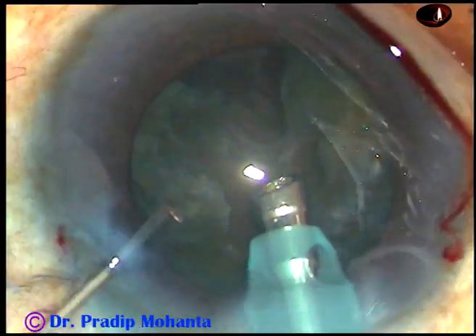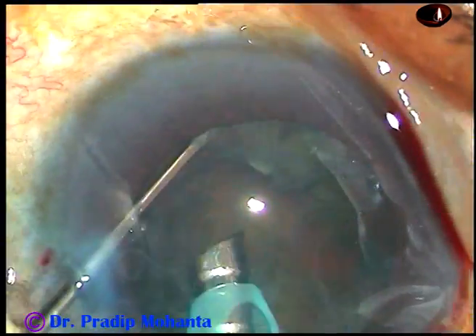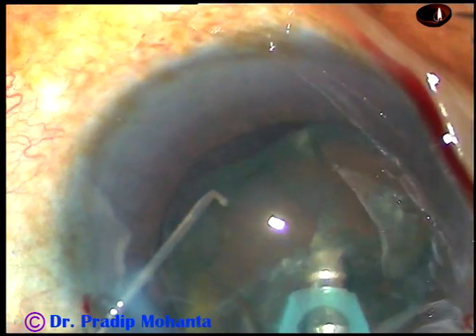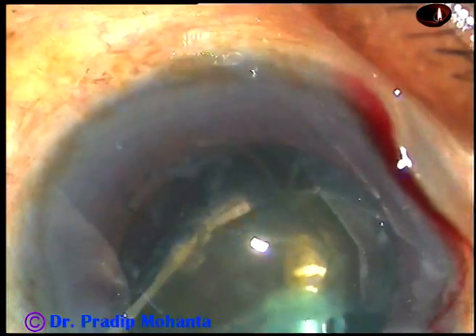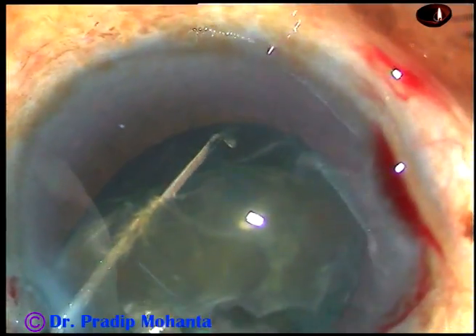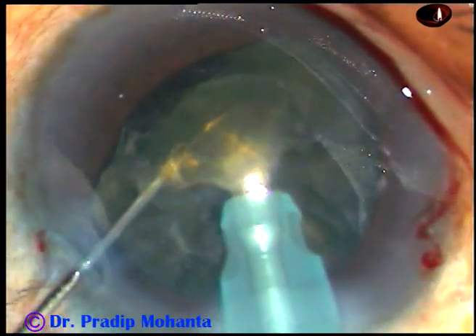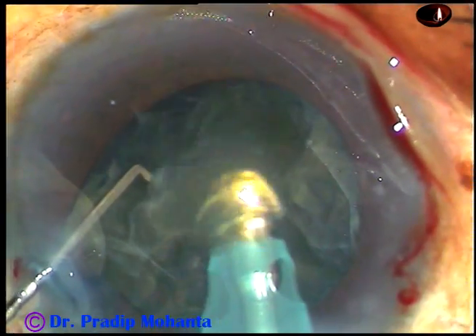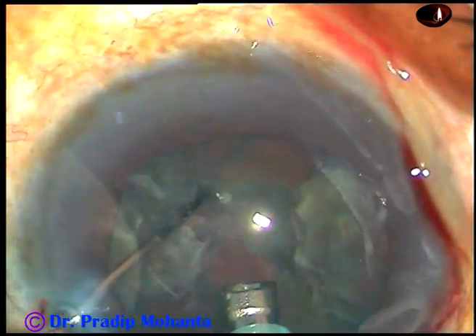And now, I rotate this nucleus, go to the other equator. Now, apply vacuum here and tilt this part. Now, one cut, two cut, and three cut. Then, one sweeping cut. And thus, this portion of the nucleus is made free and it is removed.